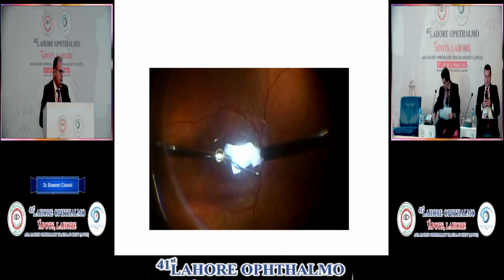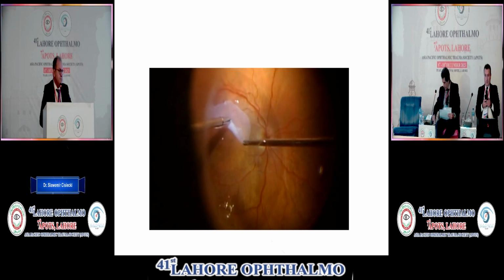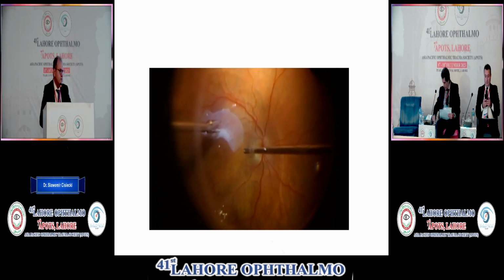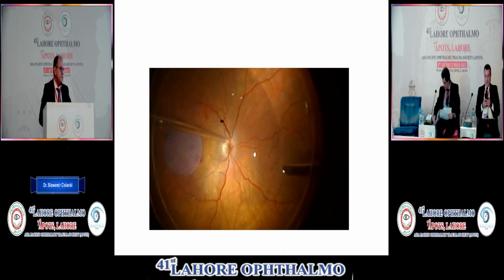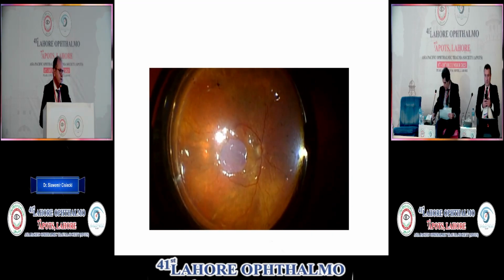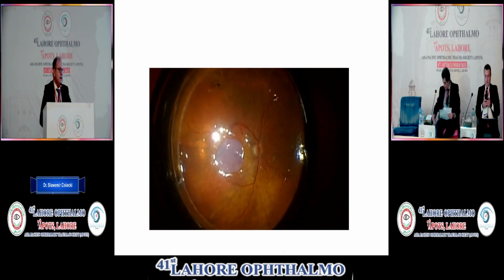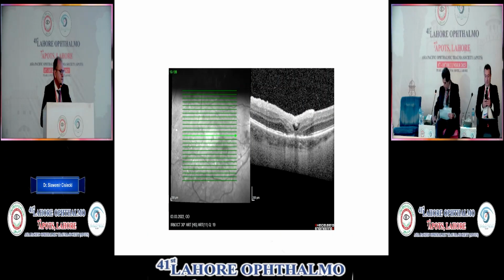I put the amnion graft, a very large patch to cover not only the hole itself but also all this area with cystoid macular edema, and I did a PFCL exchange for gas. This is the situation on the first day post-op: you can see a completely closed macular hole and no cystoid macular edema.